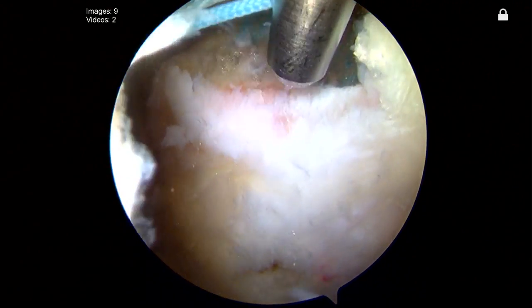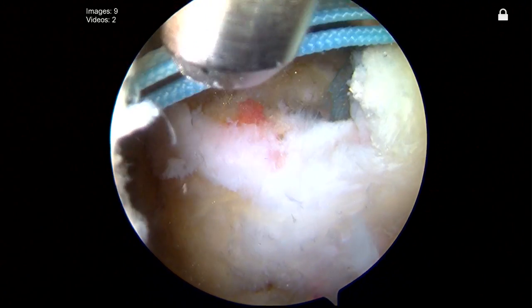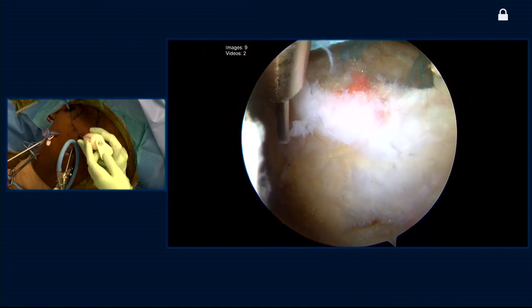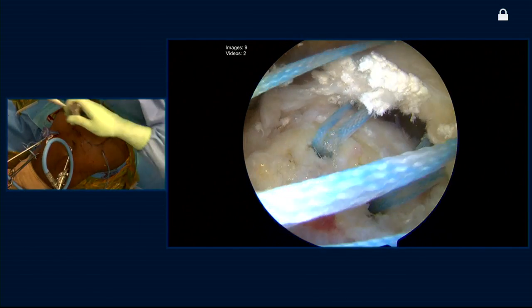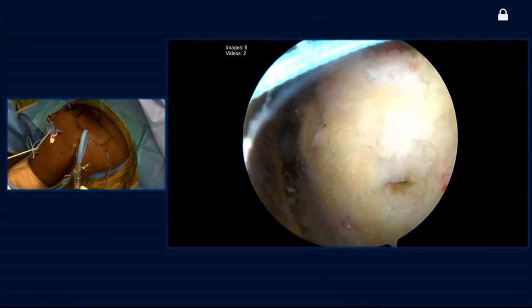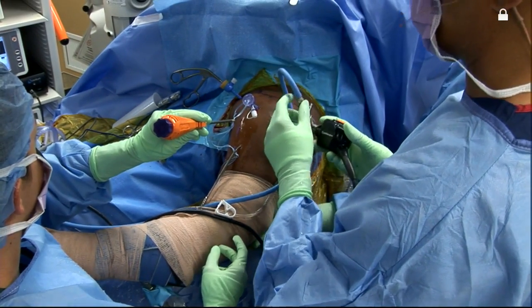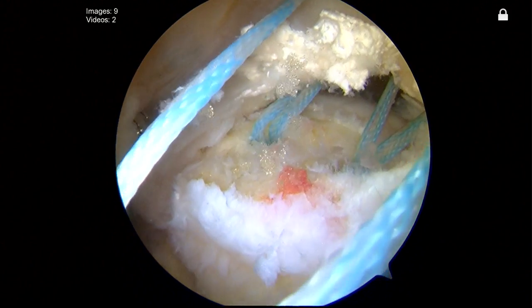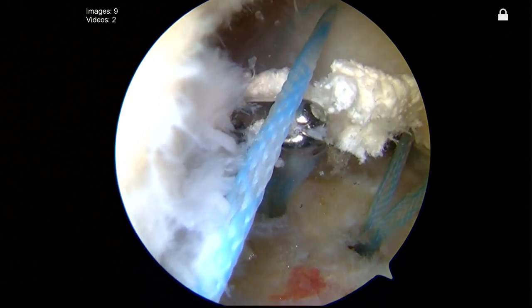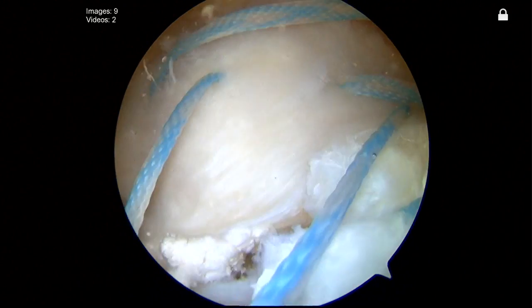How small are those holes? These are about 1.7 millimeter holes, so they're really pretty tiny. And they go about three to four millimeters deep. Once we're done, we can even do this on the lateral aspect of the tuberosity to facilitate as well. So then I'm going to bring the arm into abduction — this will allow me access to the lateral aspect of the tuberosity. We've already loaded these sutures into an anchor. What I'm going to do is have my assistant come in through the anterior portal and just help us to reduce the rotator cuff into a more anatomic position. We're going to grip the edge of the tendon and pull it over where we want it, trying to reduce it anatomically.